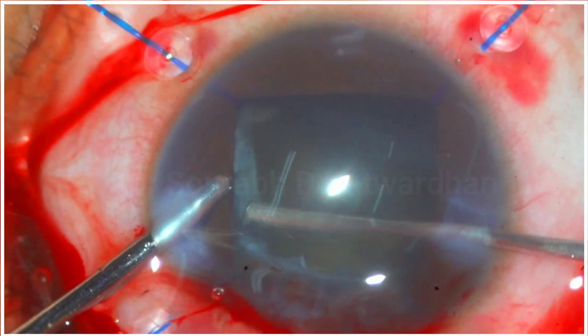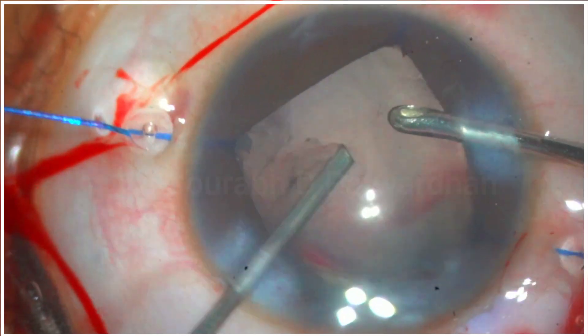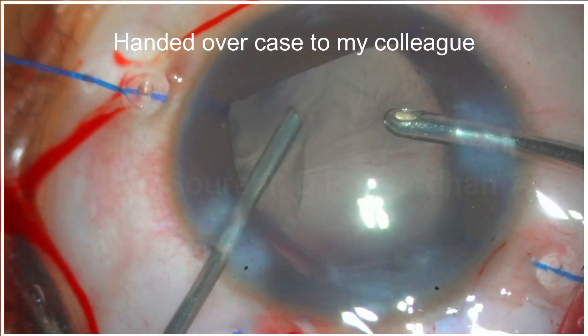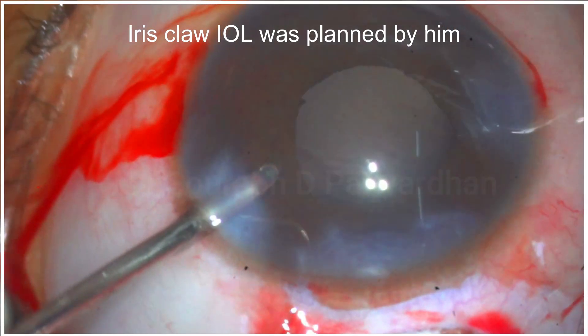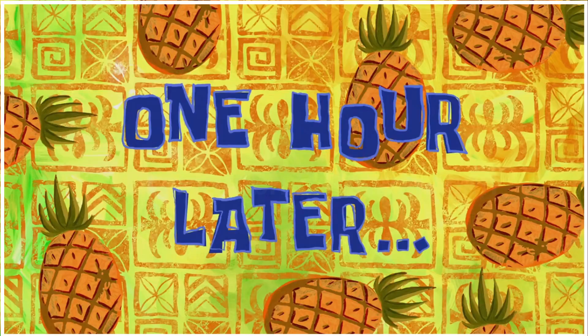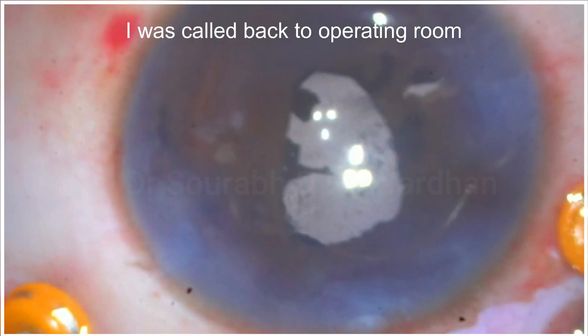I couldn't really salvage the bag, so I performed an anterior lensectomy. The PVD appeared to be complete because I could complete an almost complete vitrectomy there. I then handed the case over to my colleague, as he had planned an iris claw IOL for this case.